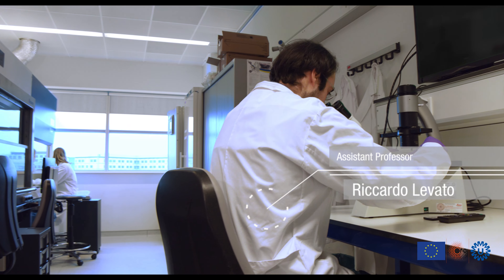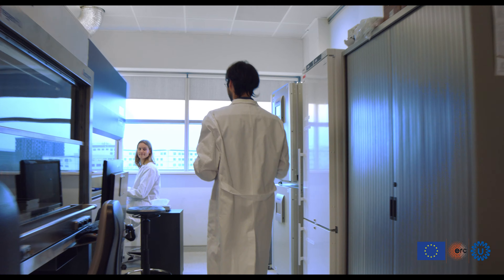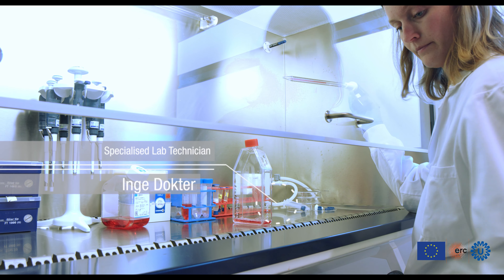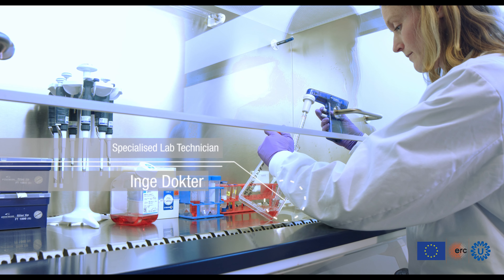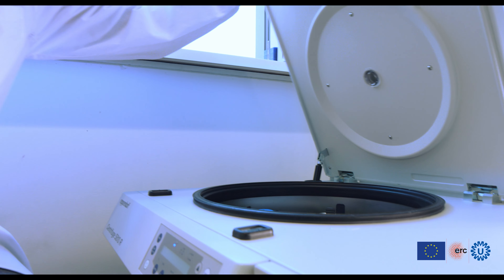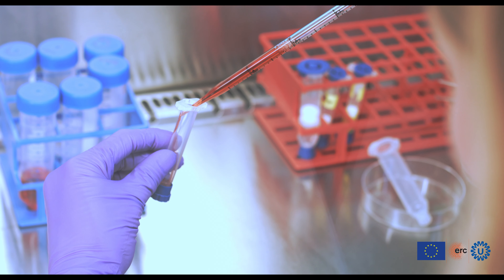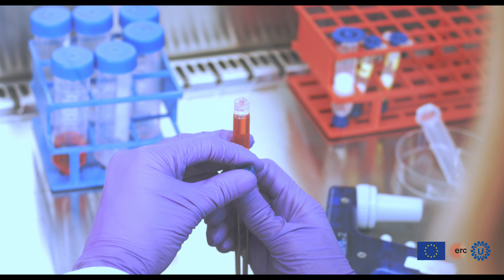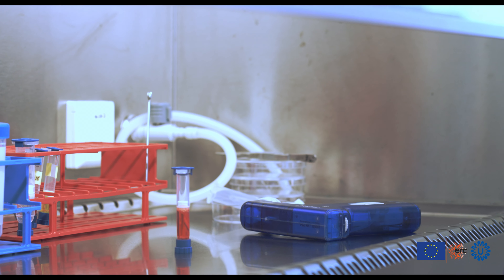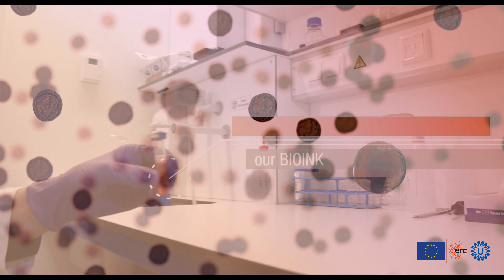Stem cells that have been cultured and expanded are harvested and mixed with a hydrogel. This cell-laden suspension is called bio ink and is then used as building material in the bioprinting process. The bio ink is loaded into a cartridge, which is then mounted on our 3D bioprinter.